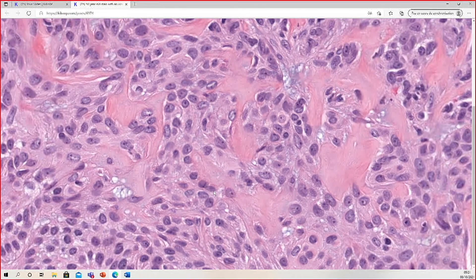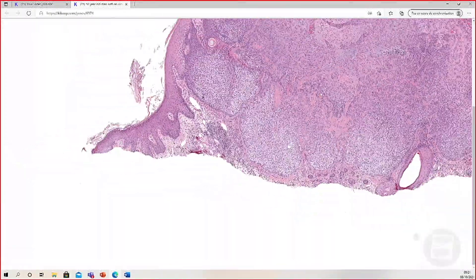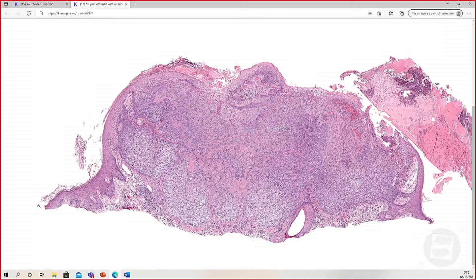If you go straight into 40x or 80x objective, you'll find some atypia or mitosis and then call it malignant and be afraid. Don't be afraid. Look from low power first. This part of the lesion in the center looks very busy, very complex, scary — kind of like cancer from low power.